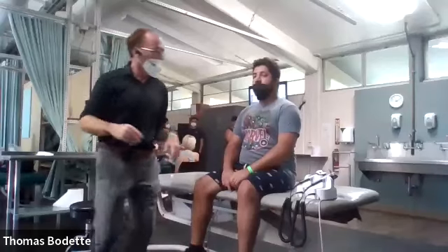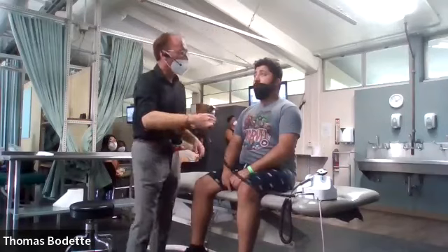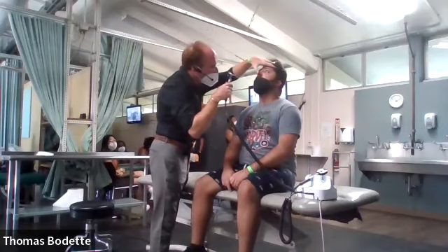Everybody got that? Okay. Right, so now we're ready to go. Complaints on the left, we're going to start on the right. I'm going to put your head back. I'm going to press in like so, and I'm going to look inside.